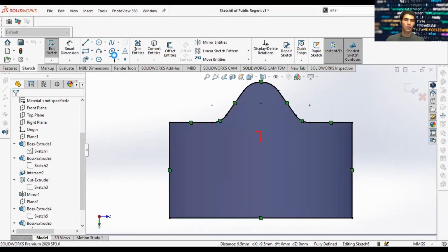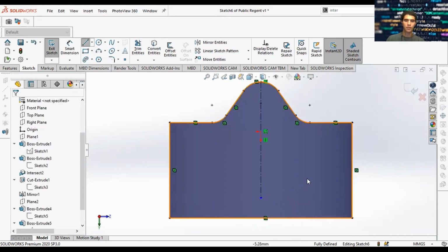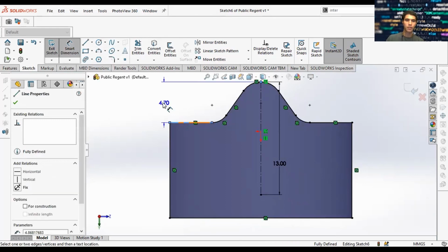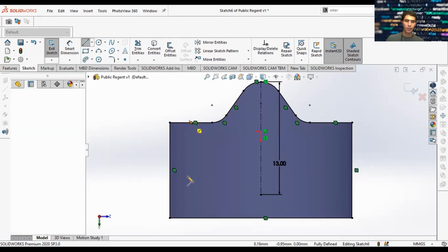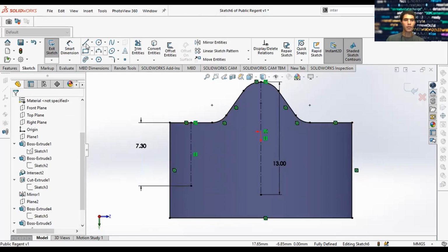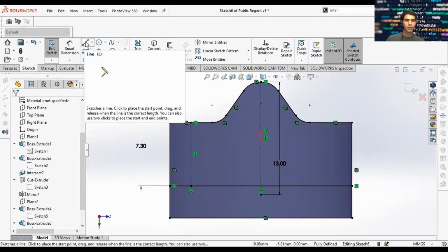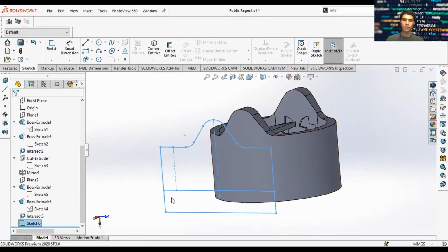And this is useful because we're going to find the 13 millimeter mark, which is somewhere around here. Measure it. 13 millimeters, and from here to here, it was 4.7. Here to here. 8.3. So I want to be 7.3. All right. So this is good. Let's go ahead and close that. And now we have our side profile.